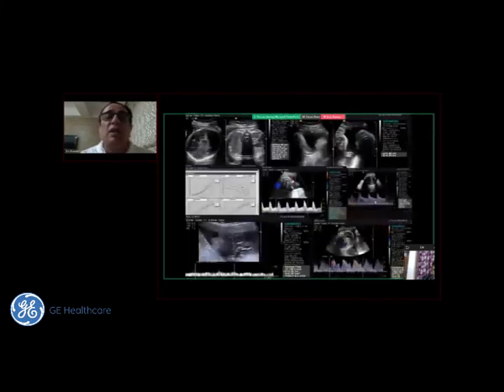Another fetus here grows well till about 36 weeks, normal growth on the 50th centile, and a good amount of diastolic flow in the umbilical artery, increased cerebral circulation, and look at the ductus venosus, high PI in the ductus venosus.